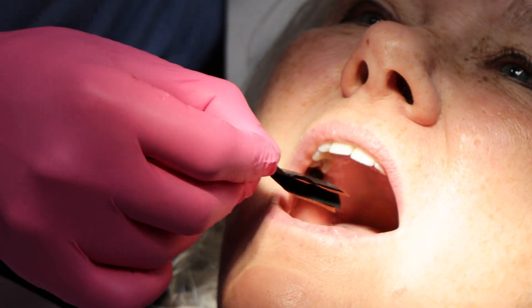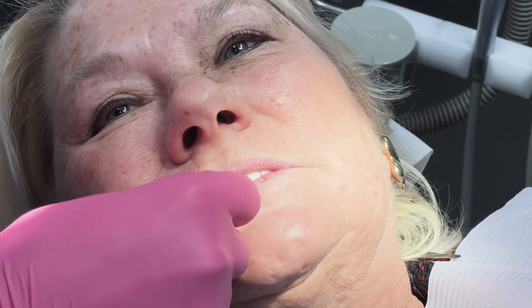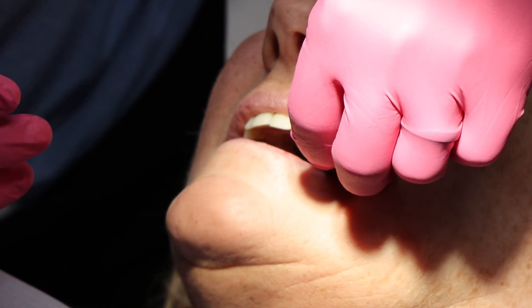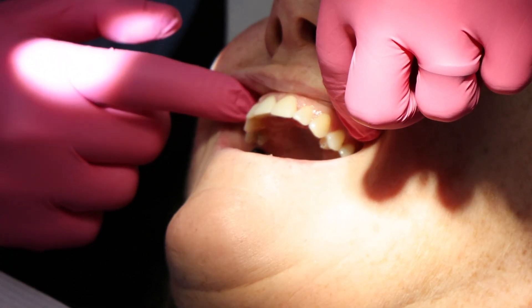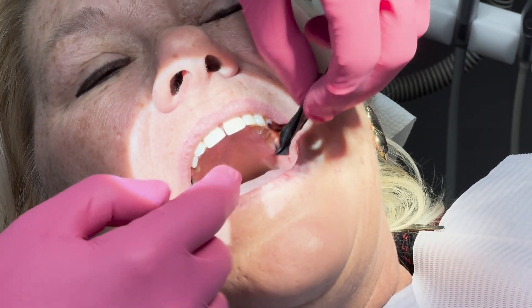I don't feel like they're connecting anymore. In the back? And open. Turn toward me a little. Bite together. Same thing - up and down, up and down, up and down, and open. Bite again for me. And bite. So you're still hitting these back teeth, which is good. But does it feel like this back crown that we did last time is still a little bulky, a little high? Yeah. Okay. So I can do some adjustments on that as well.